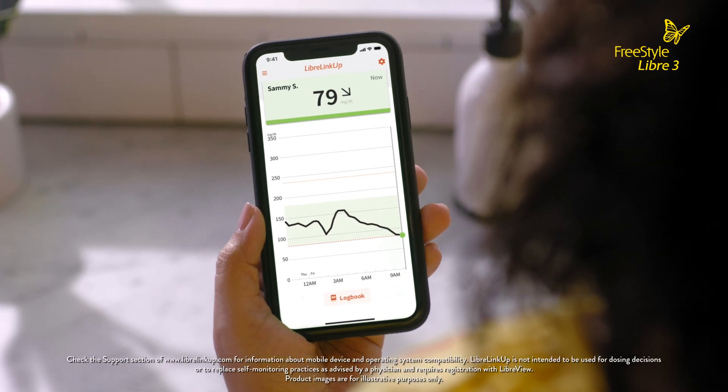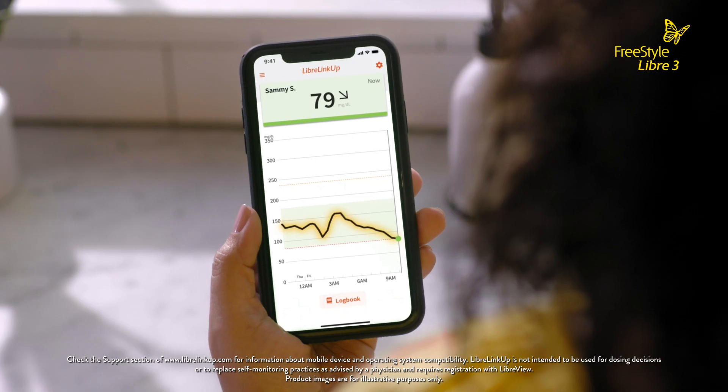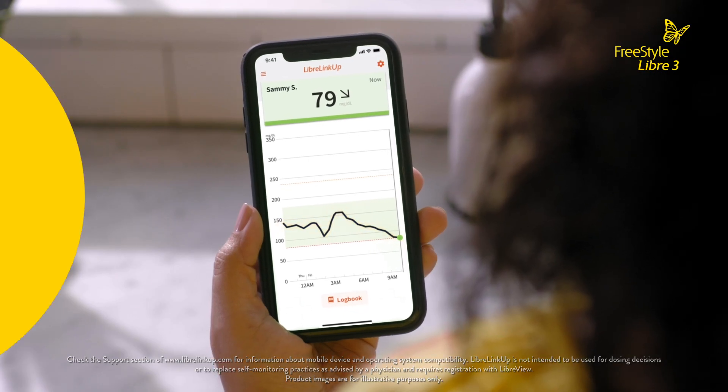With LibreLinkUp, I can see my daughter's current glucose, glucose trend arrow, and an interactive 12-hour glucose graph from the home screen.